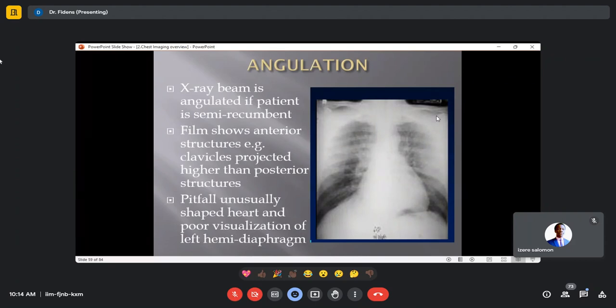It's in the respiratory system. Who taught you this? That course? Dr. Babane Jean Felix. Okay, I know him. So tell me about the silhouette sign then.